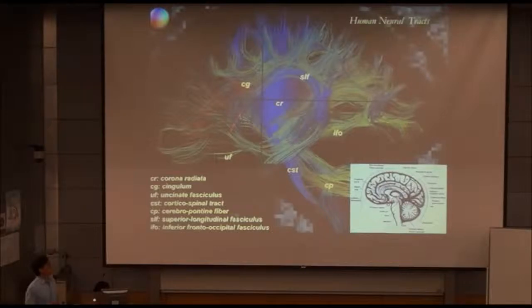And this is another technique I want to share with you, based on a kind of MR technique we call diffusion MR. It's another MRI technology that we can use to detect neural structures. Both techniques I will introduce to you later.